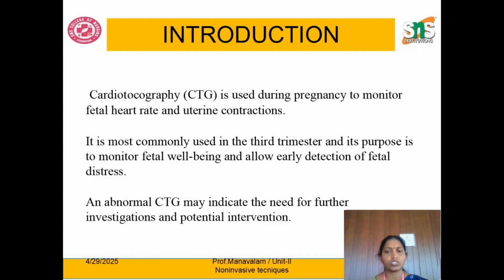At the same time, it is not only detecting fetal well-being, it is also helpful to monitor fetal distress. And if we find any abnormalities in this CTG monitor, it indicates we have to do further investigation and provide intervention in order to prevent complications to the mother as well as to the fetus.